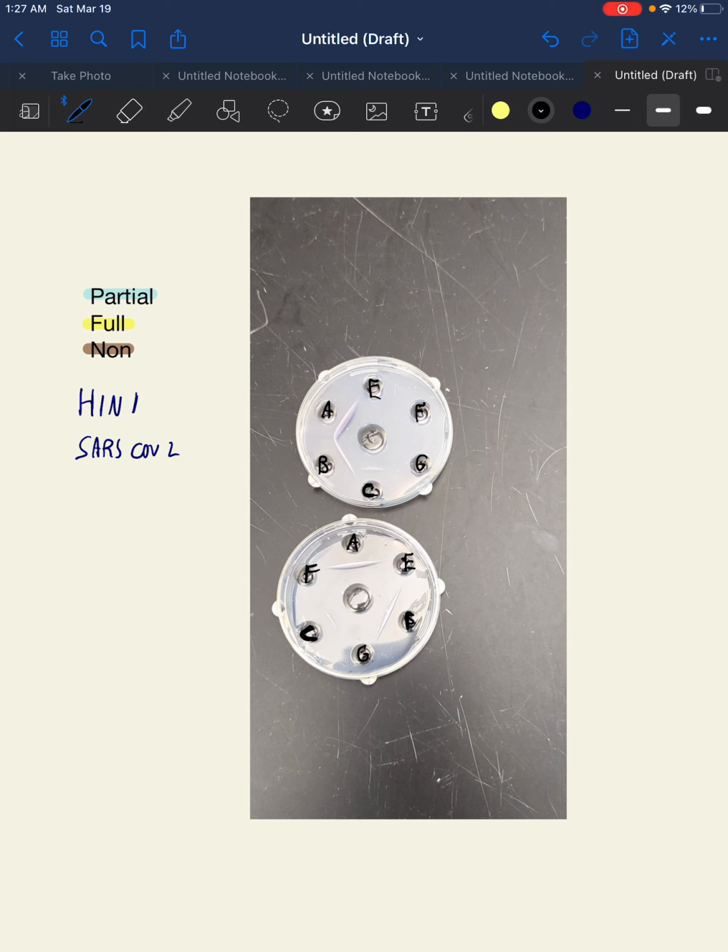Now, Ouchterlony assays is an immunodiffusion technique that allows immunologists to determine the relations between the same pathogen, or whether the pathogens on a petri dish are actually present on the petri dish. So how does this work? Well, you have an antibody in the middle of this petri dish. And via diffusion, usually using agarose so it doesn't diffuse too rapidly, it will diffuse upwards towards the antigens in question, just like this. And as it reaches the antigen in question, if it has bind specificity towards that antigen, it will form precipitate.